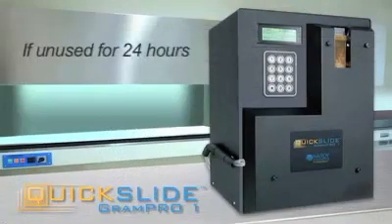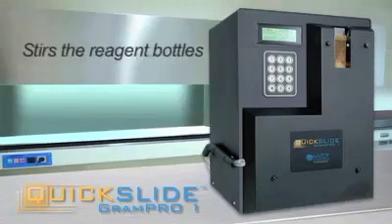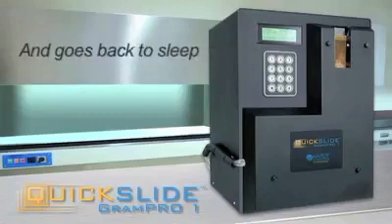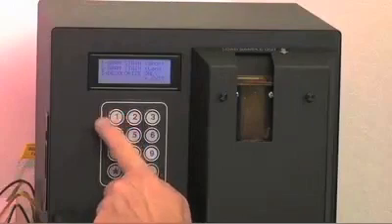If unused for 24 hours, the machine wakes itself up, stirs the reagent bottles, reprimes, and goes back to sleep. It will enter a sleep mode after 5 minutes of non-use. When you are ready to stain a slide, hit any button and the machine comes to life.